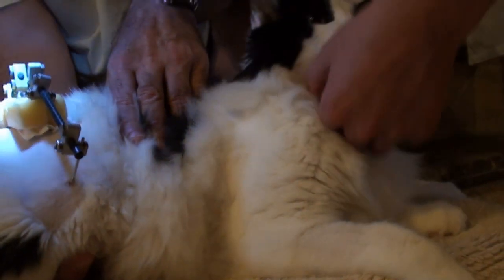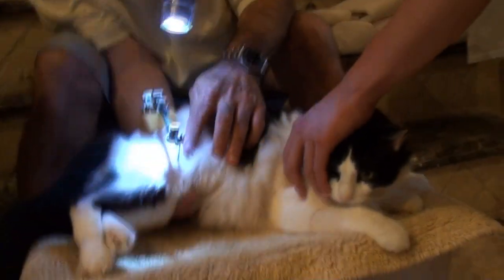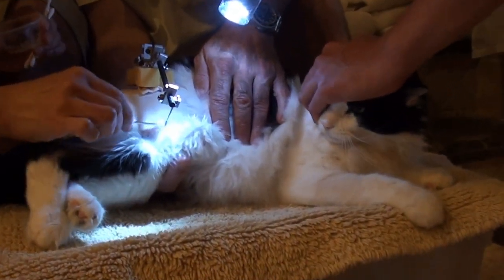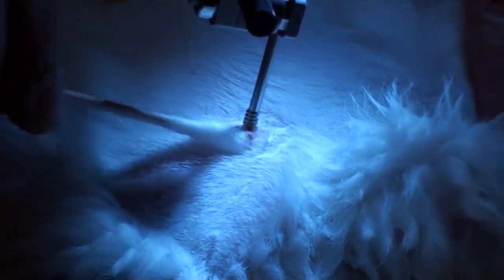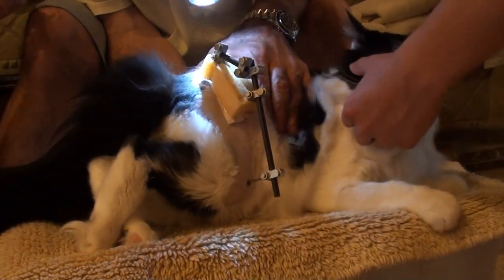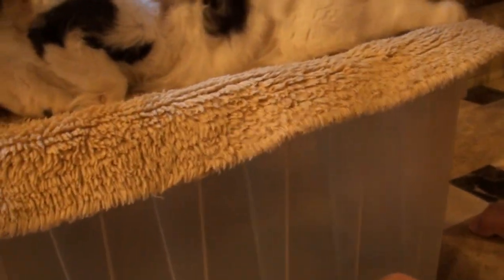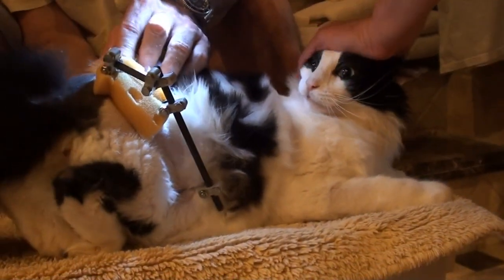He's been Conan the kitty — cone kitty. Let's get the front screw here. Even though the front screw looks perfect, we still put the hydrogen peroxide on. We're in the middle of surgery right now. Surgery kitty. That one looks good right there, look how nice that one is — just beautiful. This one back here is getting a little dirty. He's got some seepage back here. Get that stuff out of there, right there, perfect.